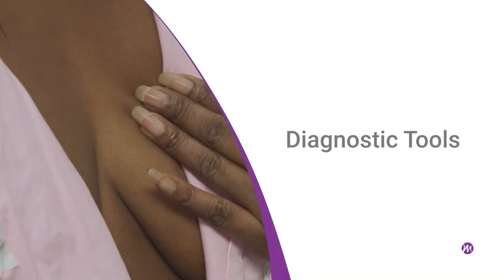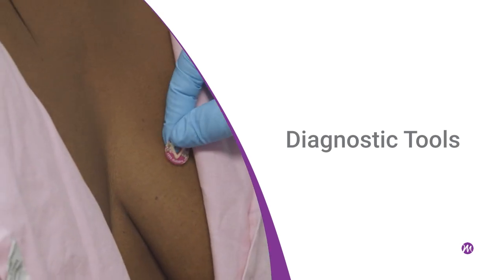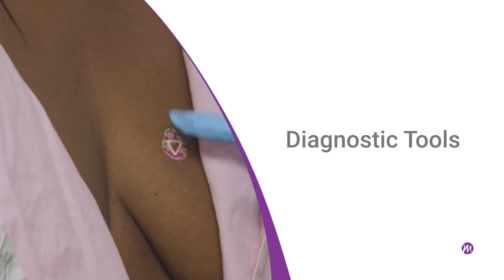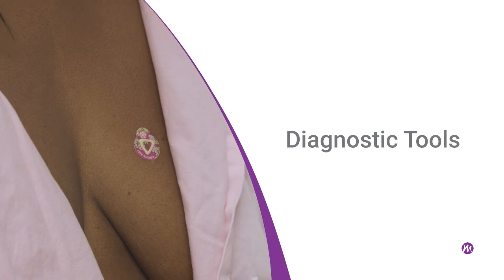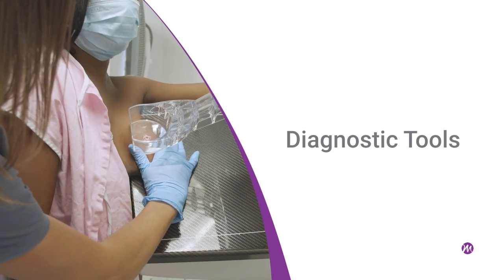At the diagnostic mammogram appointment, they will receive additional mammogram images with either spot compression mammogram images to further characterize a mass or an area of whiteness that we see on the mammogram, or they may receive magnification views to further characterize some calcifications. If a mass is detected on the mammogram, an additional tool that we may utilize to evaluate that is called a breast ultrasound.